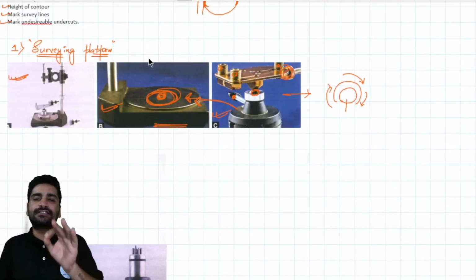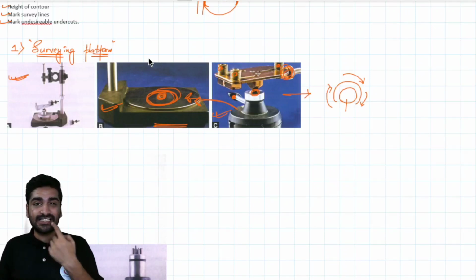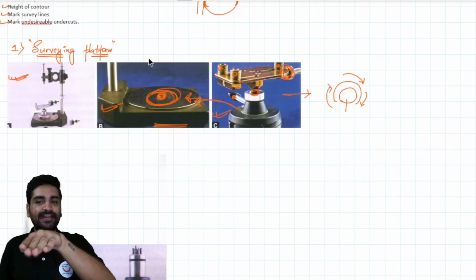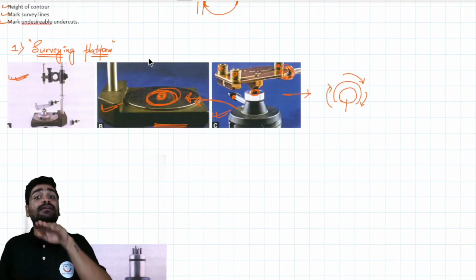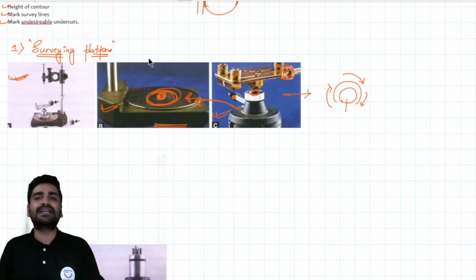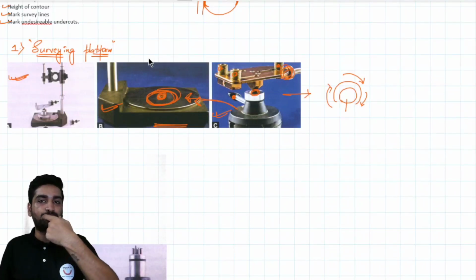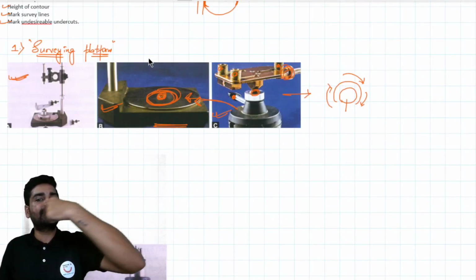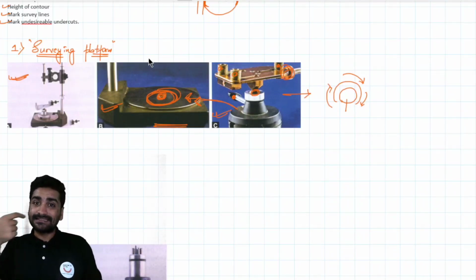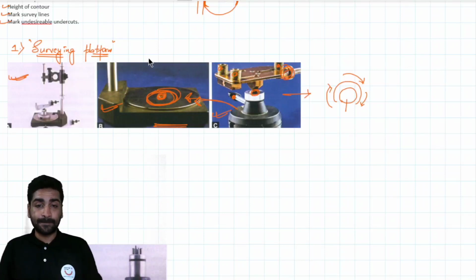Okay, so this tilt should not be more than 10 degrees. Why? The reason is your mouth is small. If you give a tilt of more than 10 degrees in the cast holder, the same tilt has to be given in the patient's mouth while placing the RPD. And you cannot tilt such a big RPD more than 10 degrees and place it in the mouth. It is difficult to place the RPD in a mouth if it is fabricated with a tilt of more than 10 degrees.